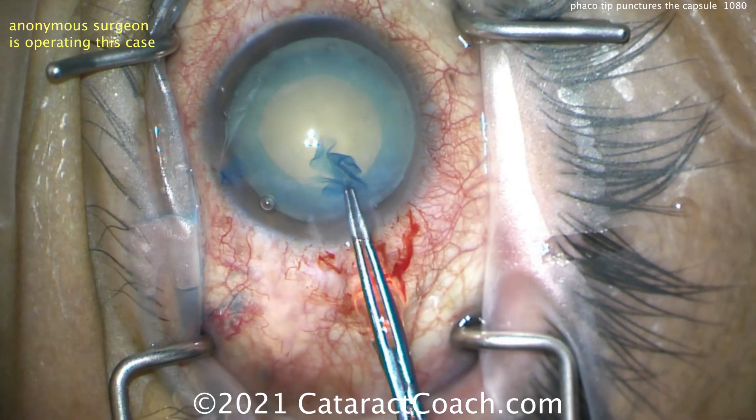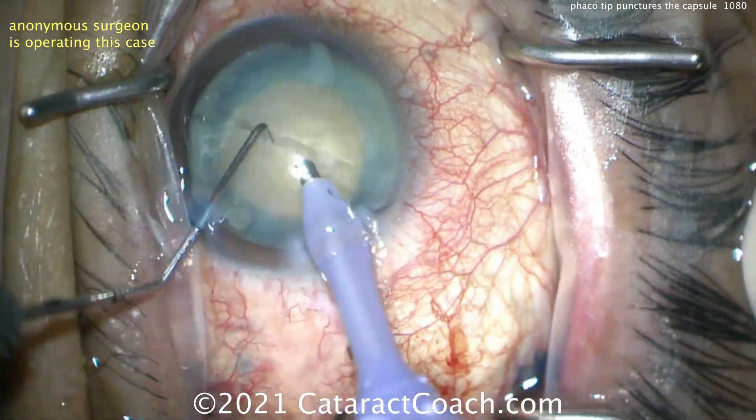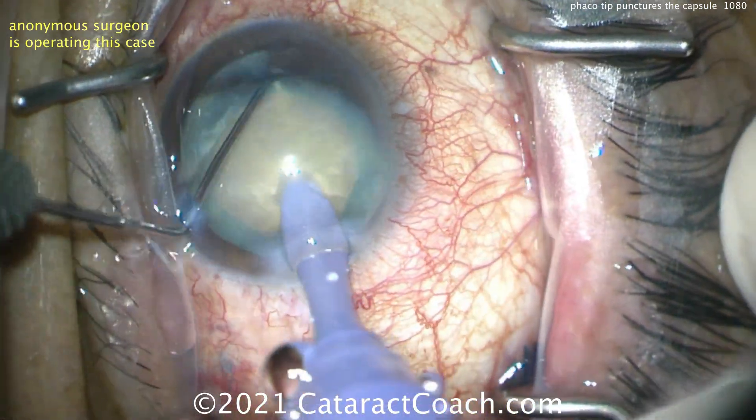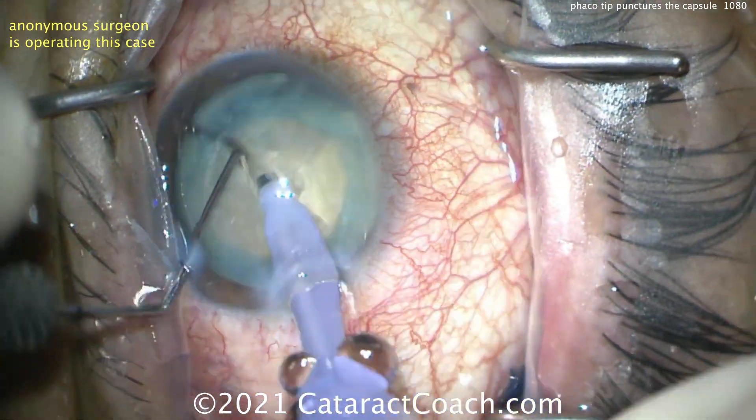Good rhexis. Trypan blue dye staining — I like that capsule rhexis. Nice phaco chop technique, and another chop. With a lens like this it's quite dense, it may need a few extra chops in there.